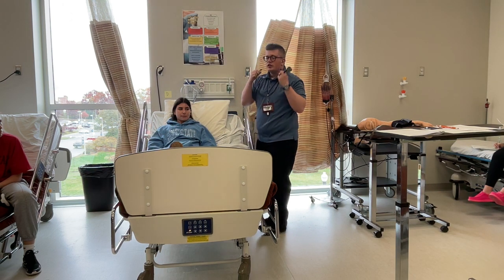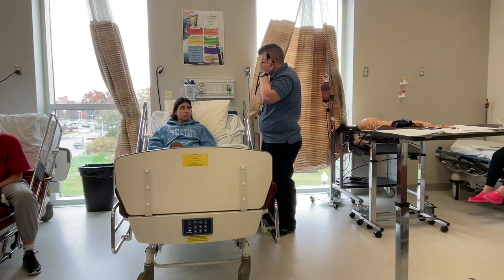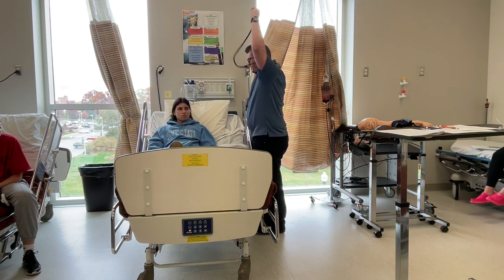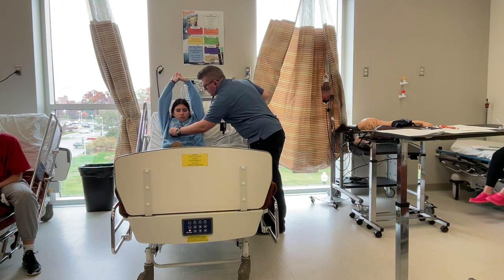Perfect. And again, in the real world, I want you to verbalize that this will be done on the skin, but we're not going to do it for the purposes of this video. So take a few deep breaths for me every time I move the stethoscope. And go ahead and reach up to the sky for me. Take a few more deep breaths. Last set or 2.